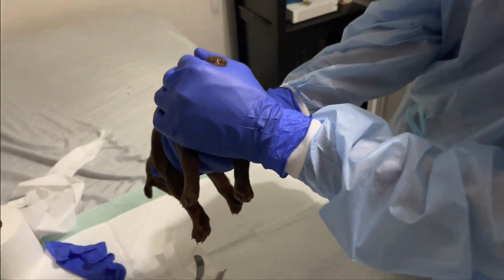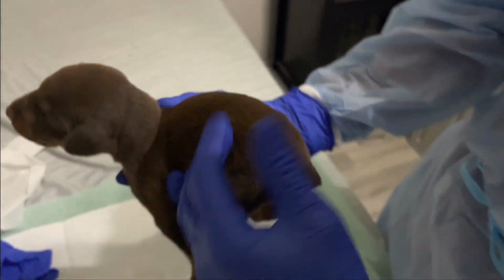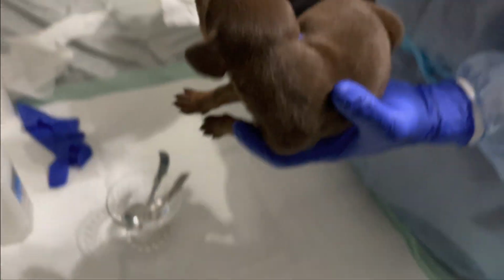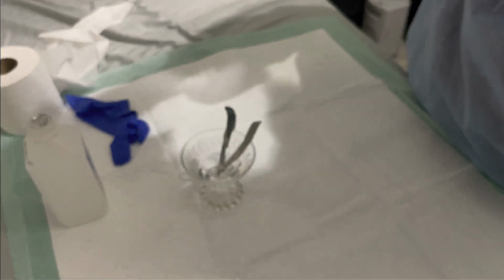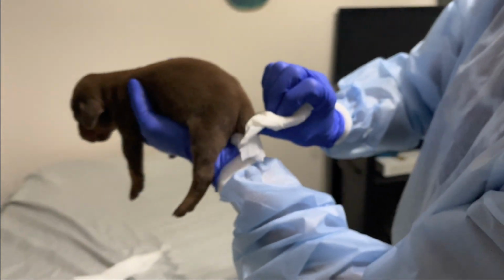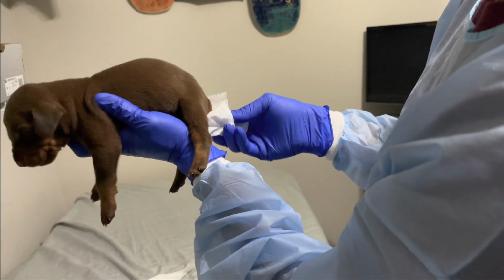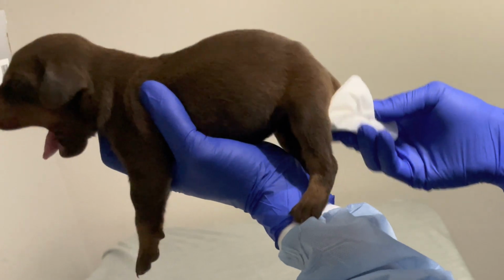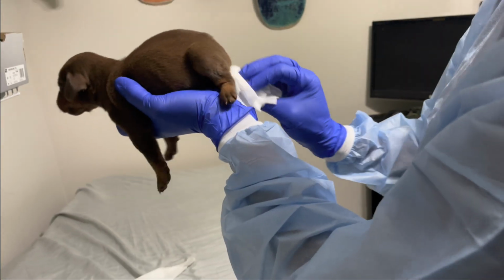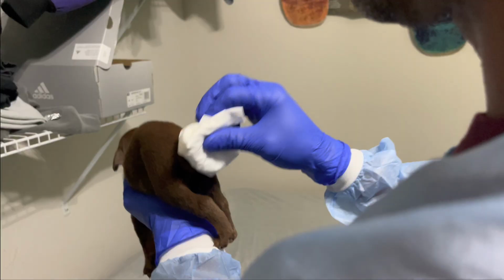And as you can see, zoom in there, you see the staple. You're gonna clean that area up. Probably hold the pup in a comfortable position so that way he doesn't squirm too much like he was just doing. I'm gonna clean that tail up. And when I say clean it up, I really mean clean it up, because you're about to pull a staple out of there.